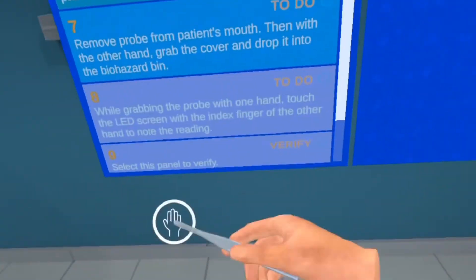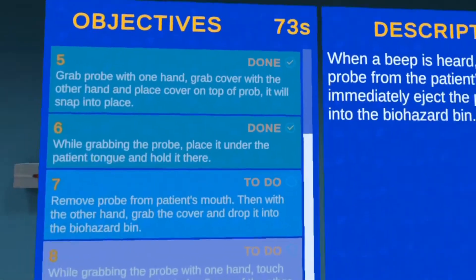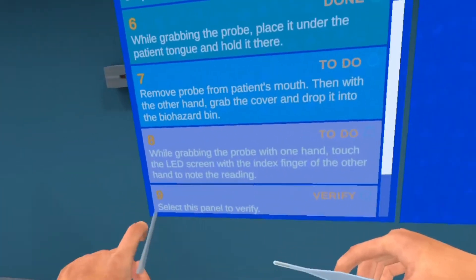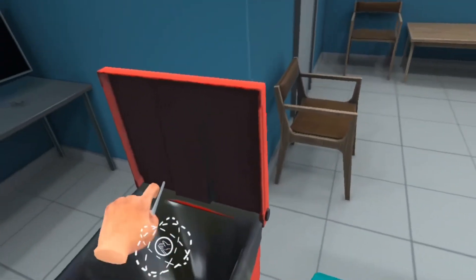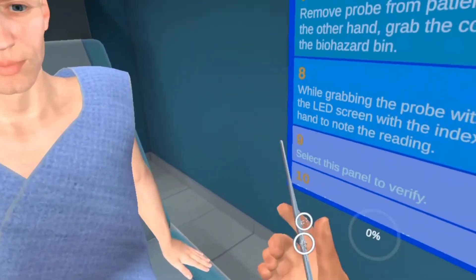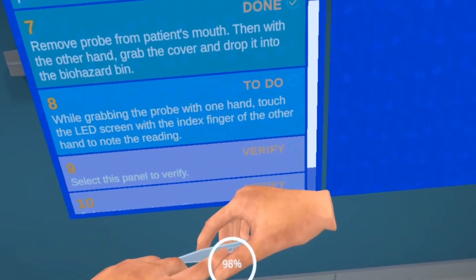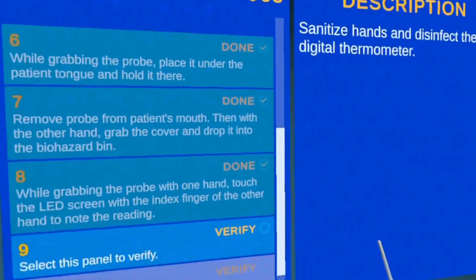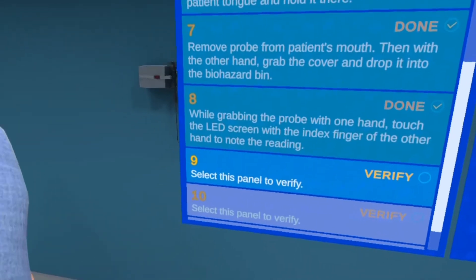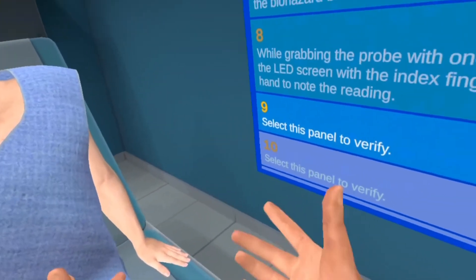When you hear the beep, the temperature reading is done. Take a look at it — 98.6 is a normal temperature. Take the probe out, remove and throw away the probe cover, then place the probe back. Verify everything with the patient, document everything, and you're done.